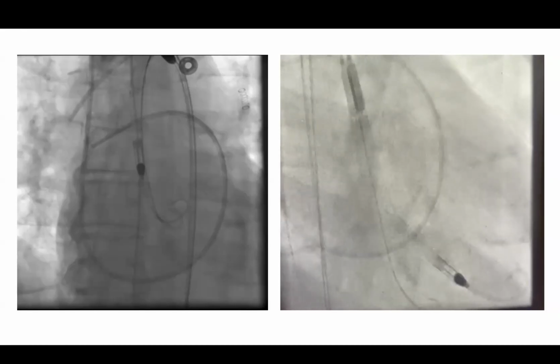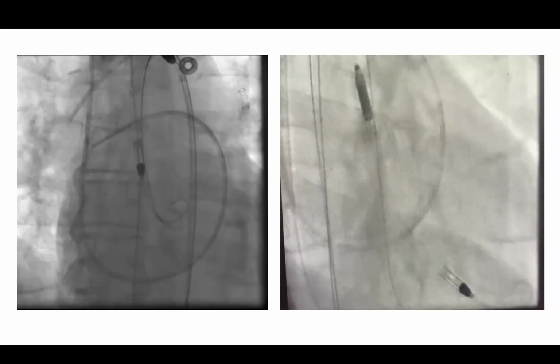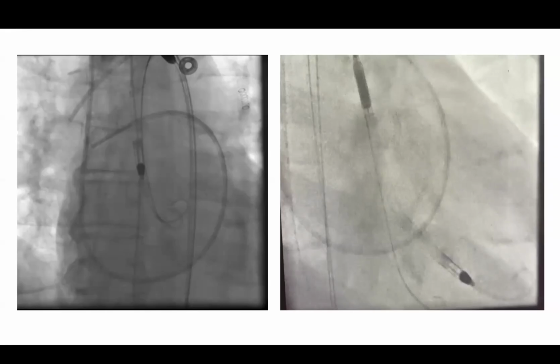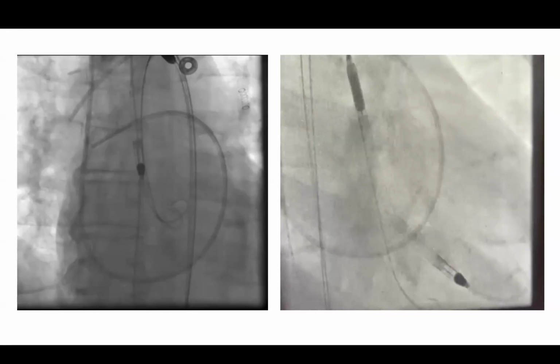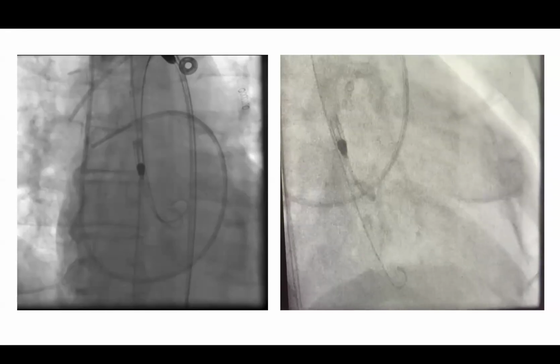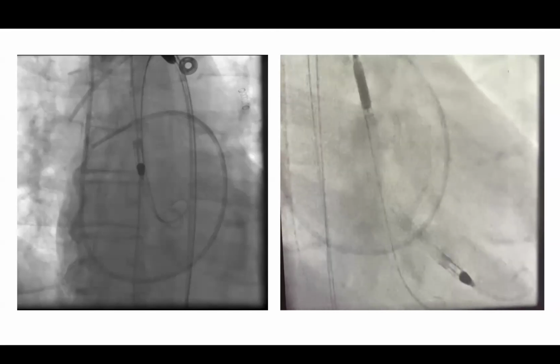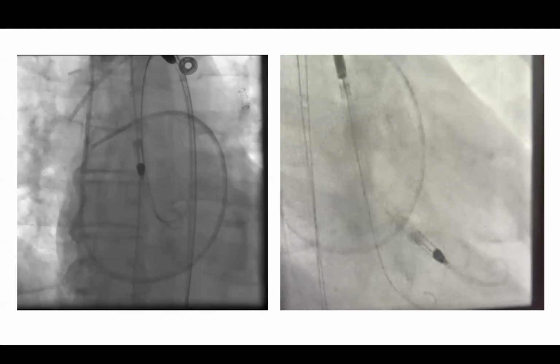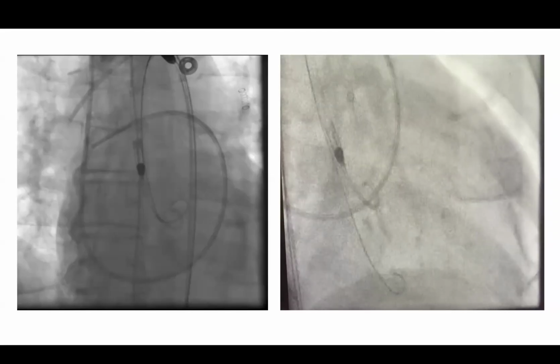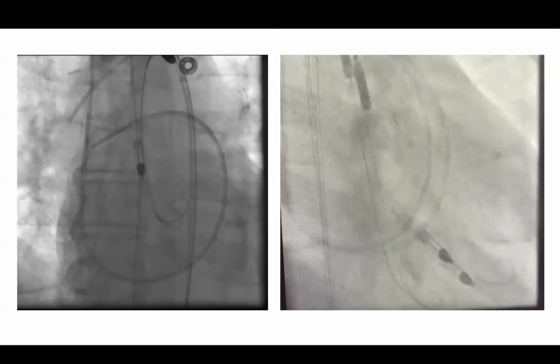I think at the beginning, I wouldn't be opposed to even pulling it back in the cath lab. Now there are logistics about that, taking a room, transfer, overnight activation. But especially at the beginning, doing everything related to these devices under fluoro and imaging guidance, it's not wrong. Let's put it that way.